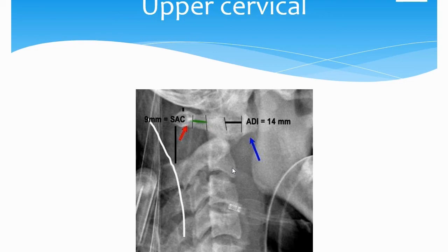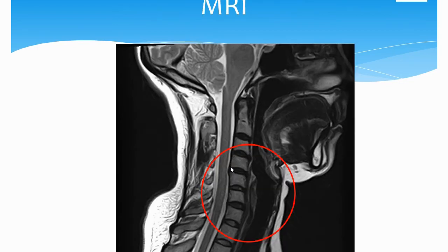of the atlas. Here is the MRI showing what we have. Not only showing the vertebrae, we have a two-dimension picture of the cervical spine, and here it shows that we have a cerebellum, brainstem, and spine, and it travels through the vertebral foramen.